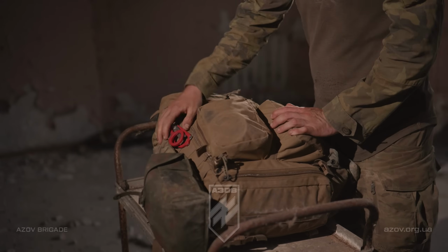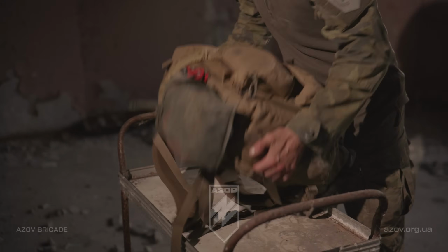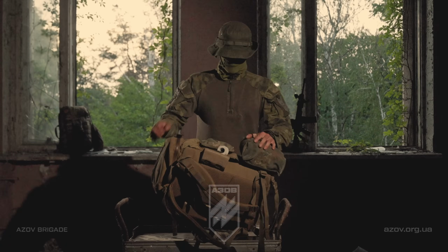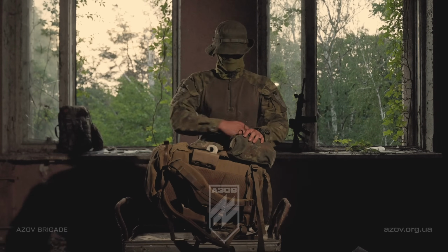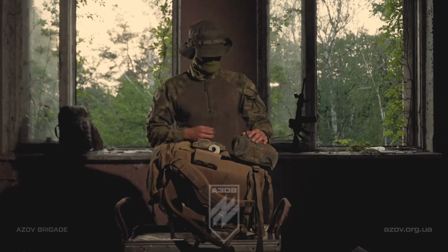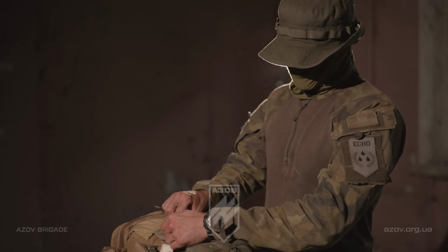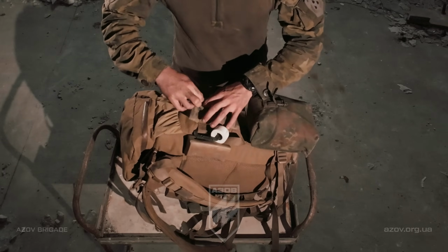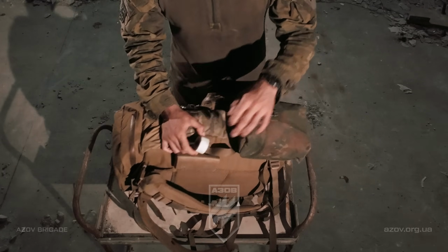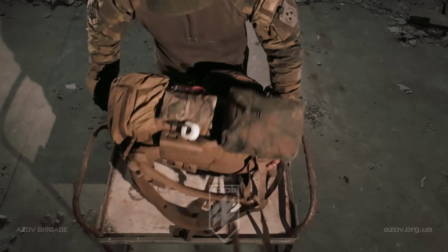So here you're going to see a set of shears. These are my backup shears, my good shears. Normally I keep a set of shears on the side of my body armour. They'll be my primary ones because they're on a rope which I can pull back and not lose them. Next to this you're going to see a little small pouch that's full of my gloves. Pretty self-explanatory. Here you see a roll of med tape. I've got one there, and then I'll have another one on my body armour as well.